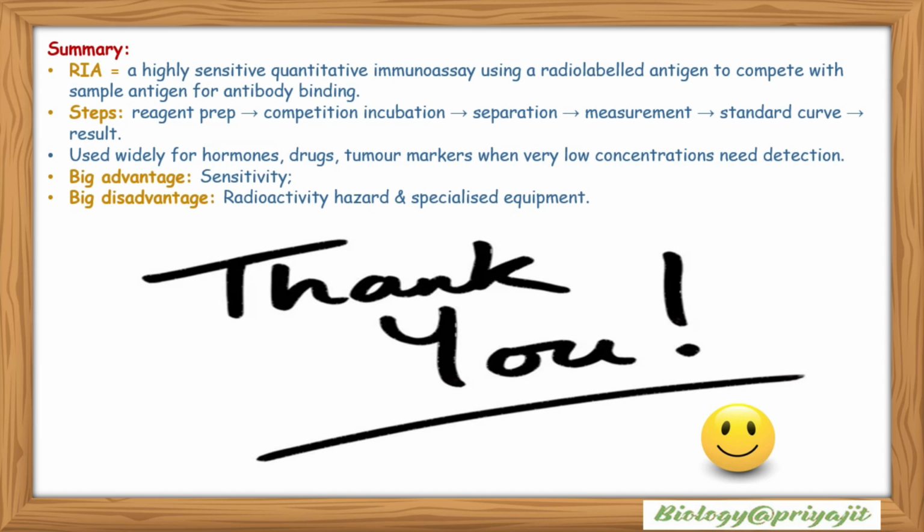So the summary is that RIA is a highly sensitive quantitative immunoassay using radiolabeled antigen to compete with a sample antigen for antibody binding. Steps are reagent preparation, then competition incubation, further separation, measurement, standard curve, and result. Used widely for hormones, drugs, tumor markers, when very low concentrations need detection. The big advantage is its sensitivity, and the big disadvantage is the radioactivity hazard and specialized equipment.